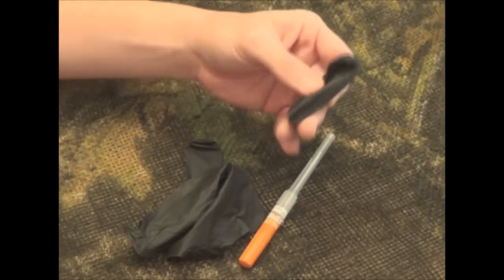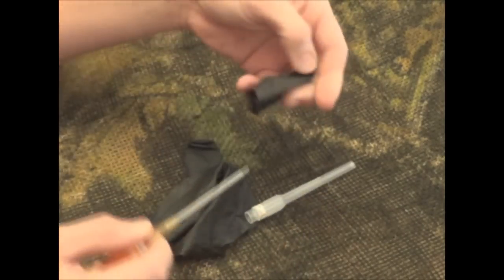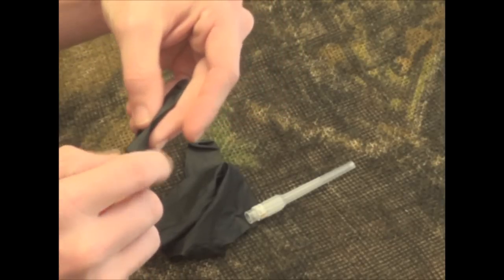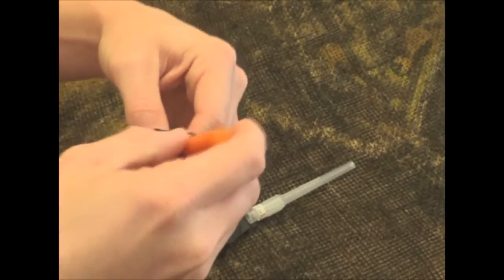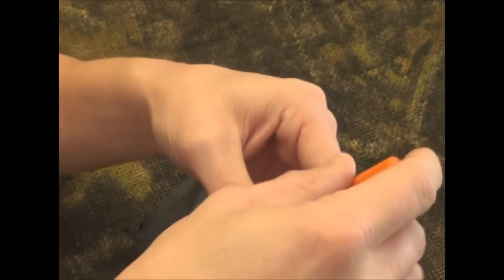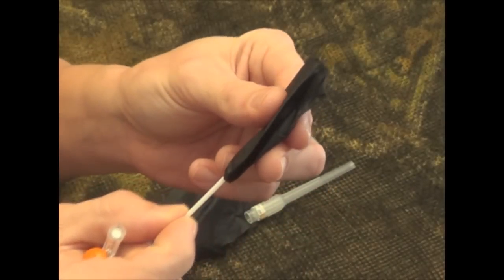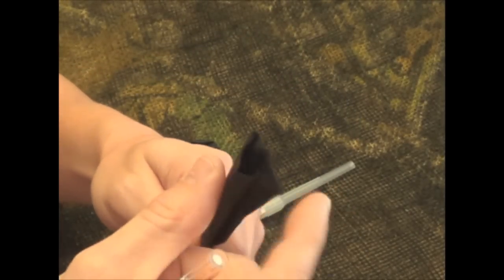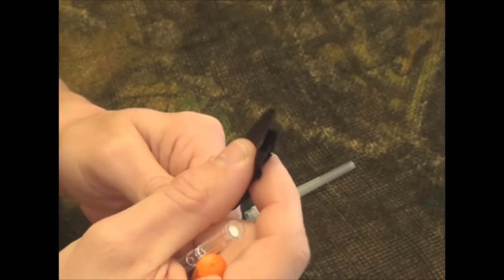If you do want to use a one-way valve, you can take and cut the finger out of one of your gloves, insert the needle through one end, and as you insert the needle, this part is going to be buried in your chest cavity. This creates a little valve here that will open and close on itself.